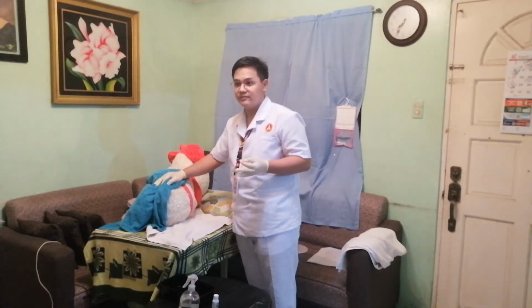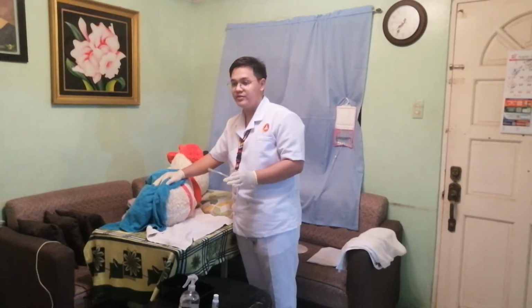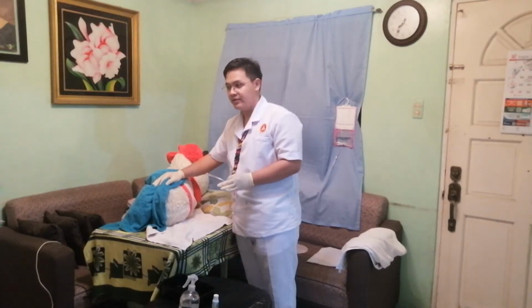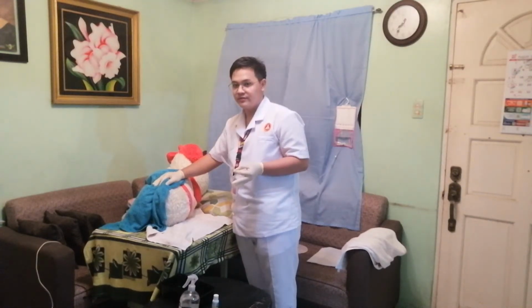Okay, so if we experience any restrictions or any difficulty upon inserting, we will need to ask our client to take a deep breath if we can access the internal sphincter, and we will be running again a small amount of solution.